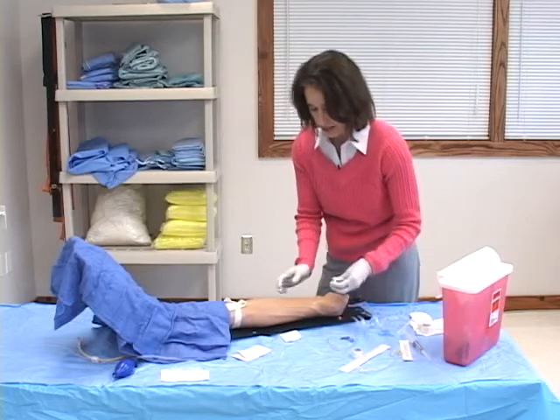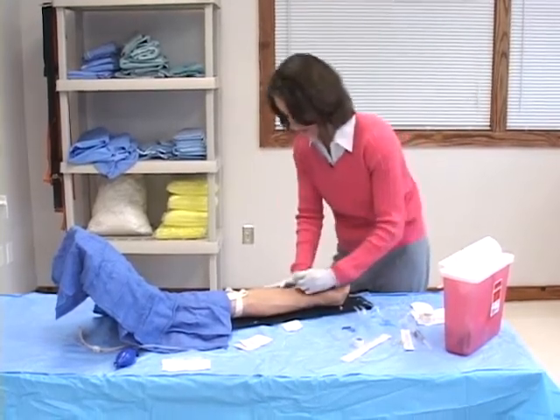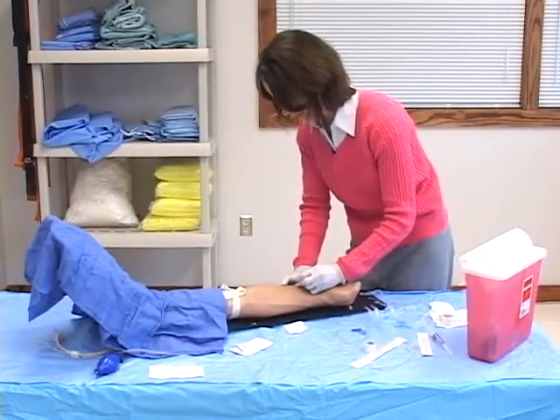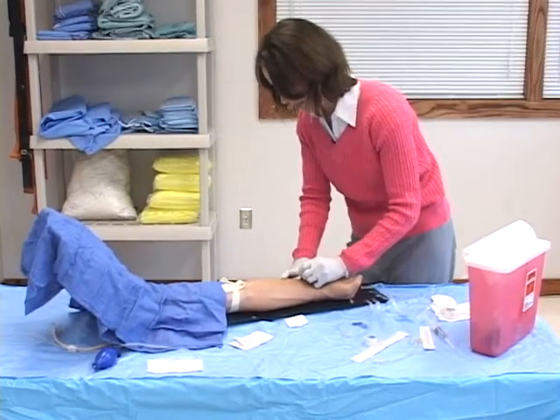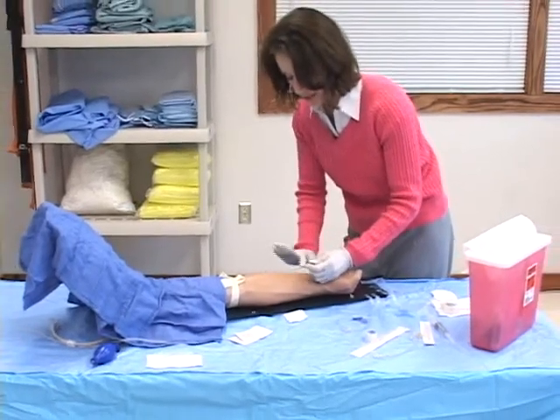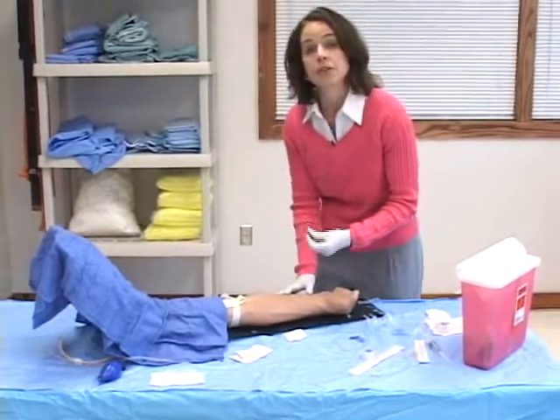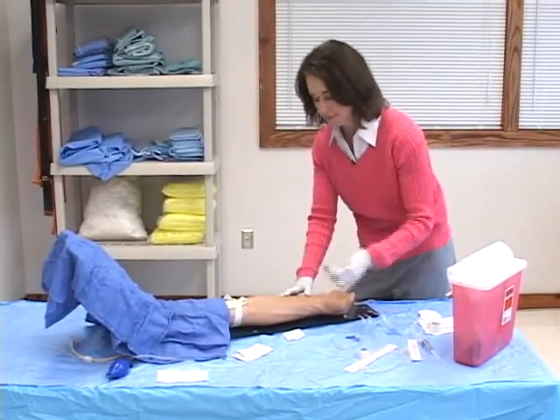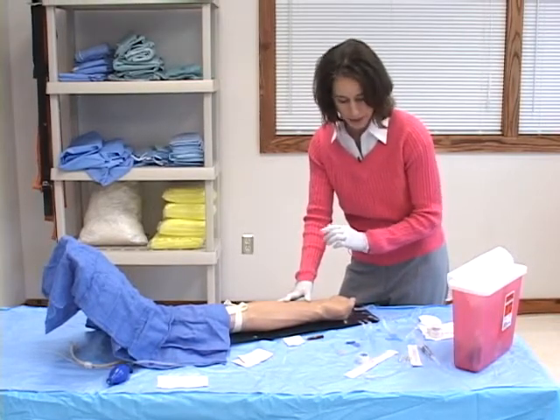Once I decide upon my site that I'm going to use, I'm going to clean it with some iodine. Make sure that that's good and clean. And sometimes if you are going to be holding in that spot, some people may want to clean the tip of their glove if they're going to be palpating that spot again. And it helps to apply traction with your non-dominant hand, and this helps prevent the vein from rolling. And I am left-handed, so things may be backwards according to what you may be doing.